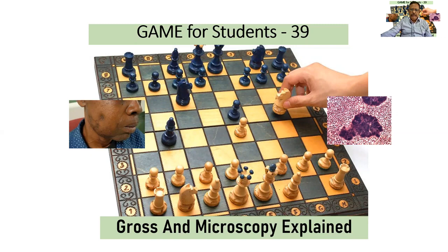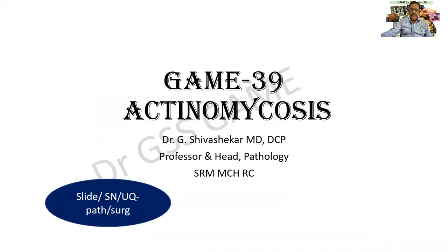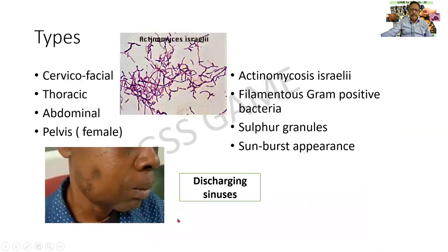I hope you identify the couple of pictures on the screen. It is a case of actinomycosis. The significance of this is given in the enclosure, and it covers a lot of subjects including pathology, surgery, microbiology, and so on.